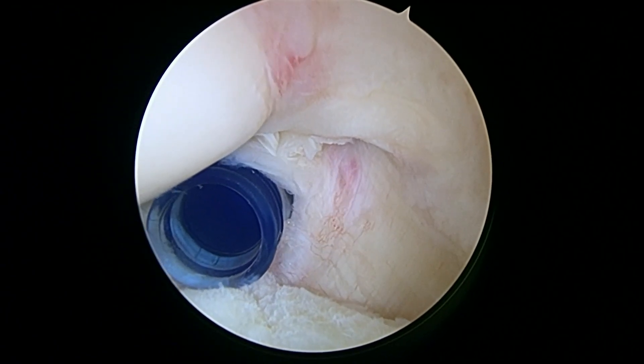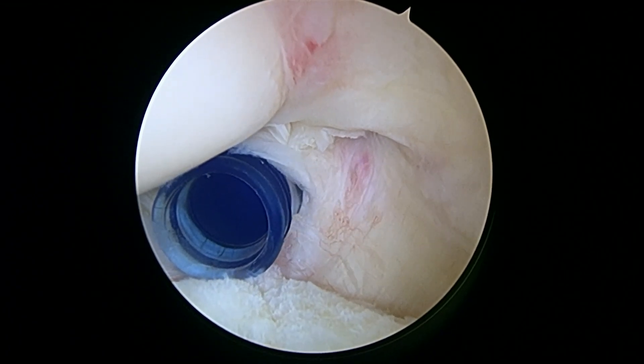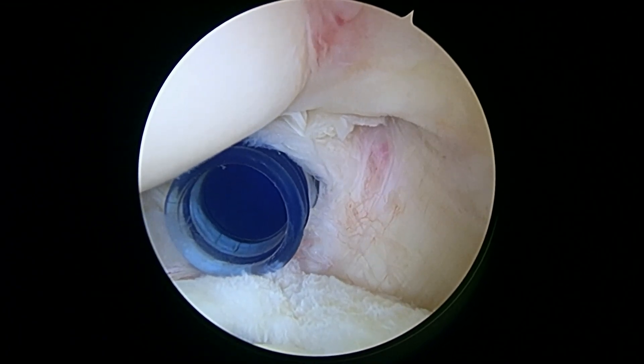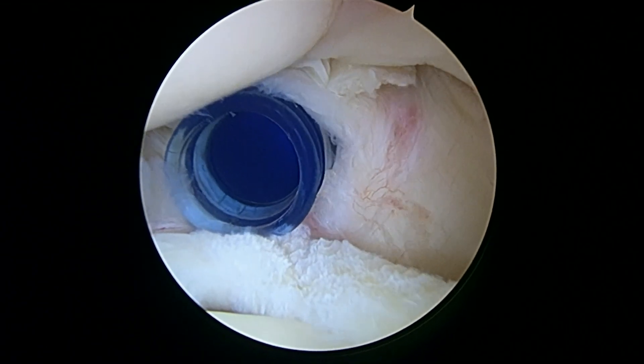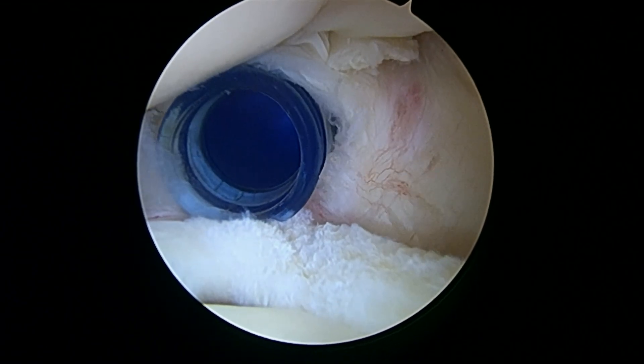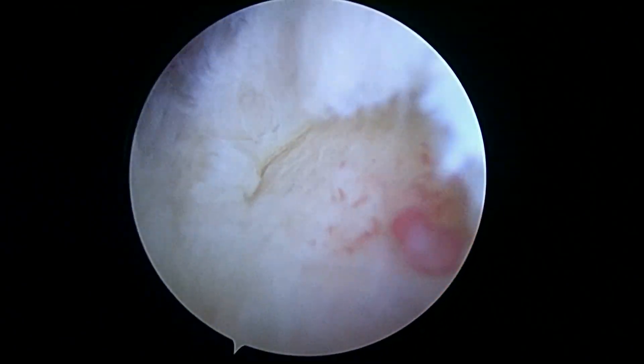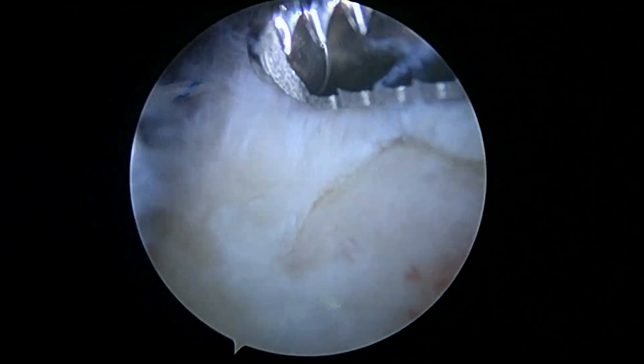Now we're going to stop here and go above the tendon where we'll inspect the tendon from the bursal side. We'll do any bone work like a decompression, and then we'll fix the biceps. So we've discovered a tear in the rotator cuff — it's right next to where the bicep sutures are, which is the most common place for this to happen. You really had a bursal sided tear.